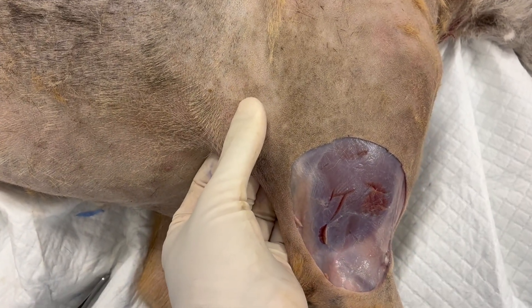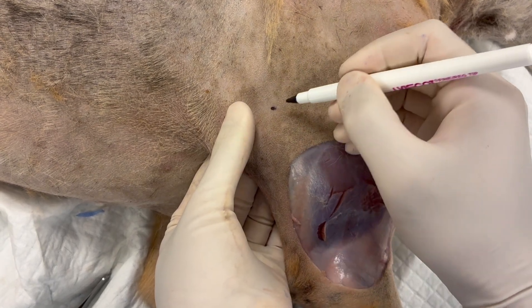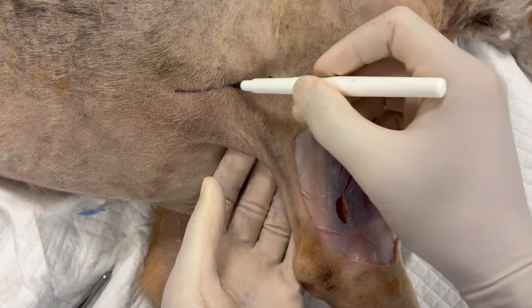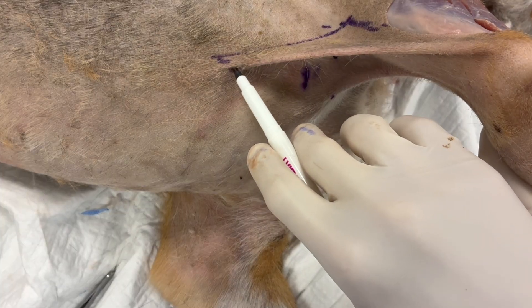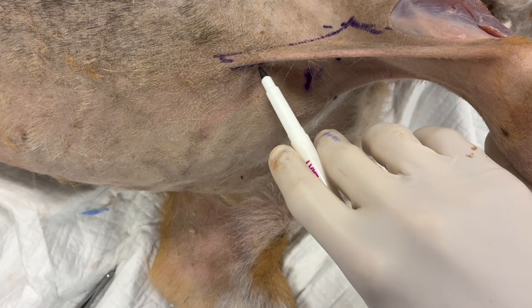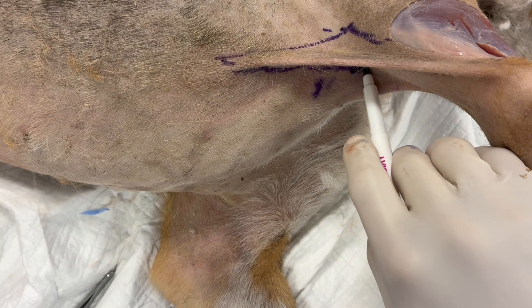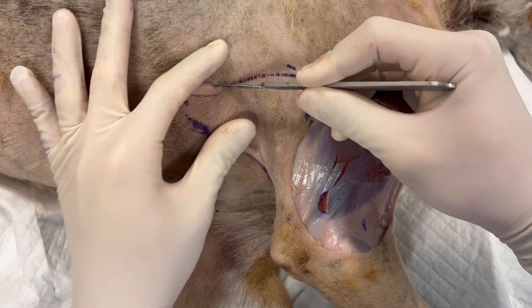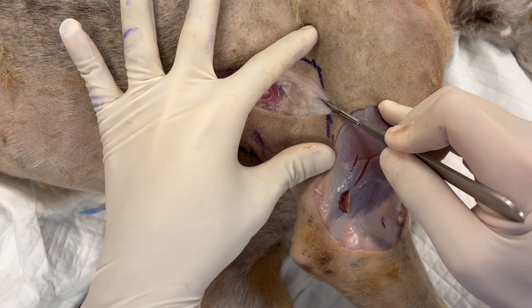Here I'm grasping the fold and opposing my thumb and fingers together to see how we can close that tissue if we remove the fold. Now I'm outlining the margins of the fold, and you can see in this case the incisions are horizontal along the thorax with the base of the pedicle on the medial brachium.